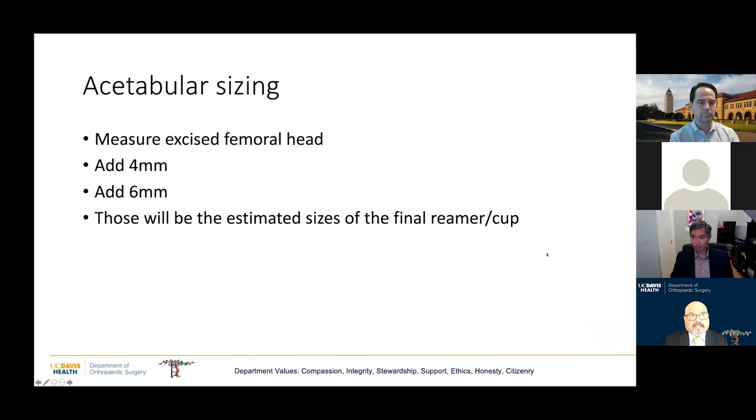A couple of words about acetabular sizing: as I excise the femoral head, the first thing I do is measure the diameter of the femoral head. This validates my templating, and if I've undersized or oversized, I know my implants may be slightly off. I add four millimeters and six millimeters to the femoral head size to estimate the final reamer and cup size. As I approach that reamer size, I want to make sure I'm getting chatter and kickback — if I'm not, something is wrong.